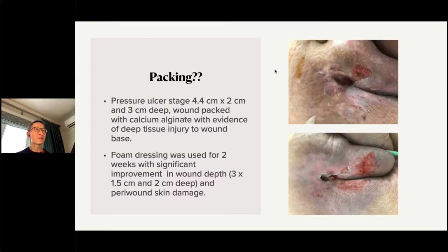And the other, newer thought that I have around the management of pressure injury is to reduce the amount of fillers and packing material in wounds. This is a series of cases that I published with another clinician in the International Surgical Technology, really highlighting that for a number of pressure injuries that we cared for, since we removed the packing material and replaced the dressing with primarily just a good, superior absorbent foam dressing, we're able to see better outcomes.